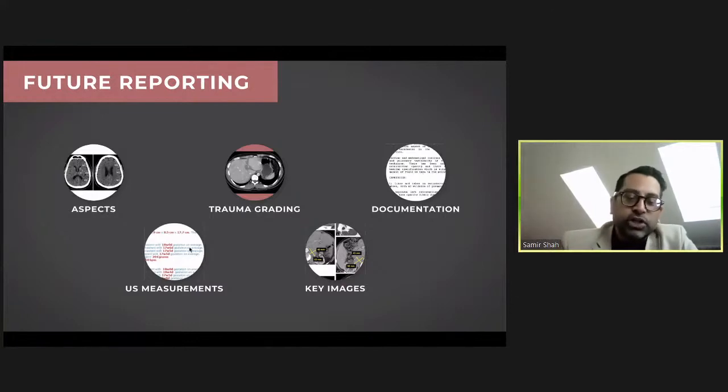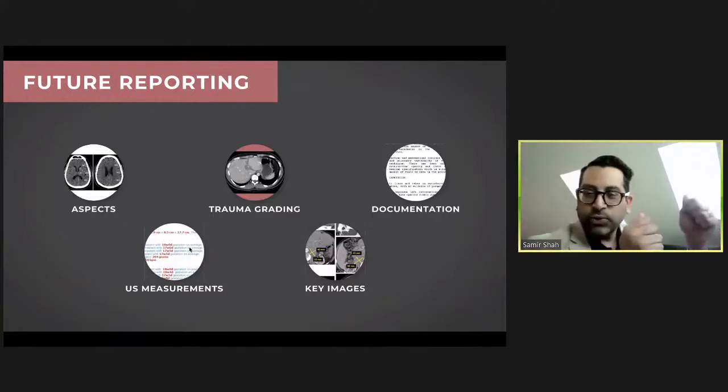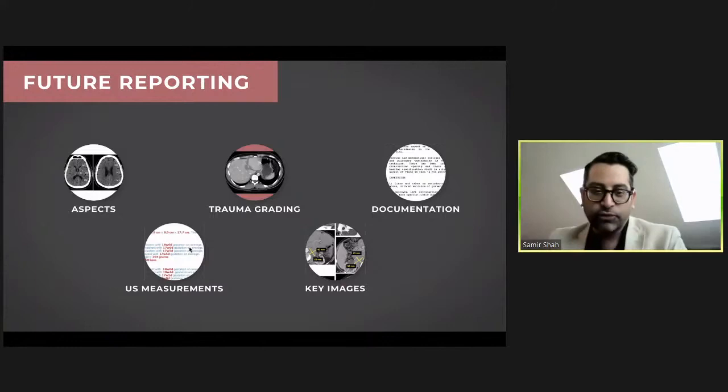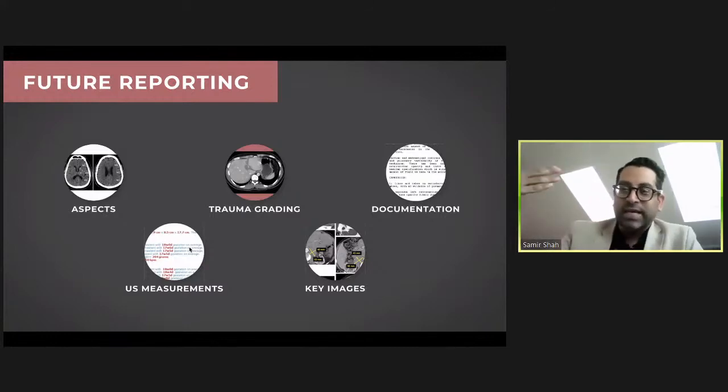What about ultrasound measurements? We have a system where an ultrasound tech is reporting a case. They measure something on the screen, then they take that measurement and they write it on a worksheet. Then they fax or copy that worksheet into the PACS, and then the radiologist dictates that measurement. I mean, there's 3 opportunities for an error. Just from the screen to the transcribed ultrasound worksheet to the radiologist dictating that number. 3 opportunities for error, and it happens. All of us as practicing radiologists know that it happens. So there's no need for that.